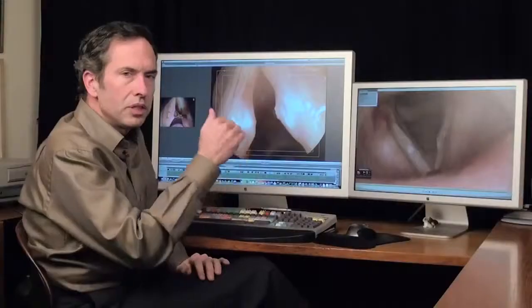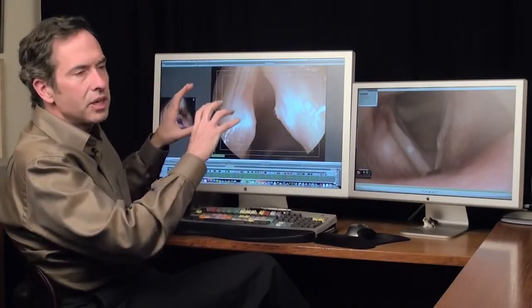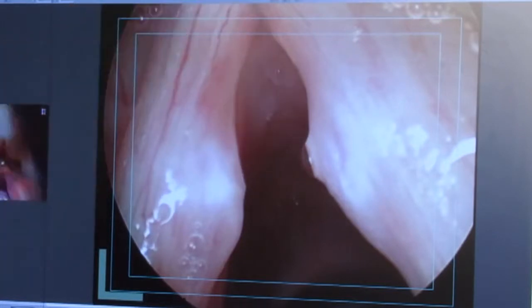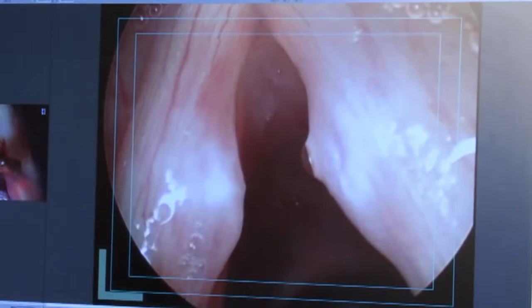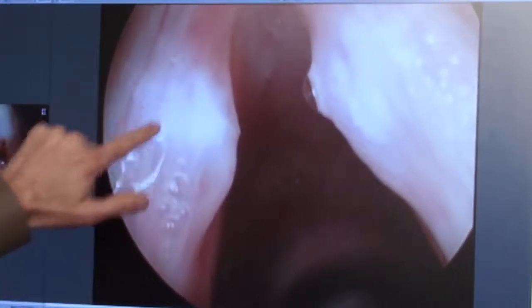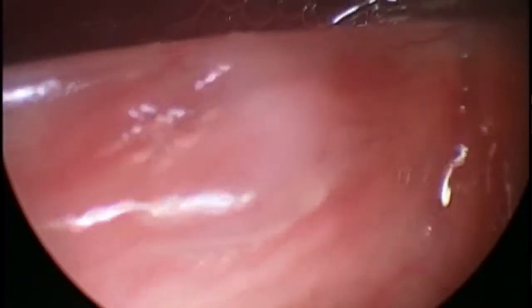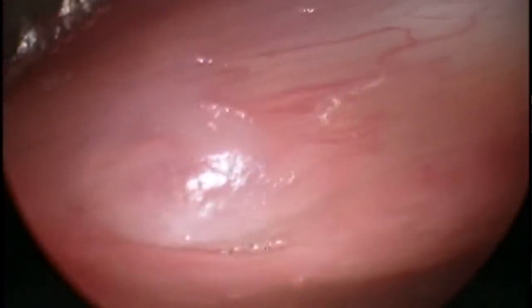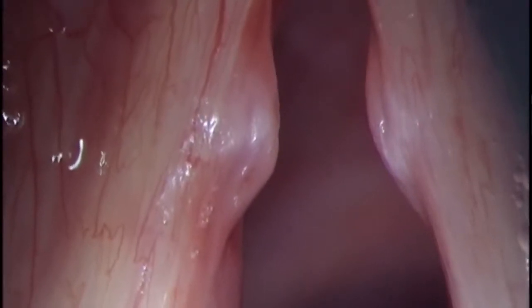Here I am looking down her throat. Now, the image is upside down because as a surgeon, I sit behind her head looking down her throat while she's lying on her back. So the front of the vocal cords is now here. We can see these two large swellings. And in fact, we're going to see blood vessels within them. Now, the swellings do have a white surface appearance. That's the callus part of it from her chronic overuse. And as I put the endoscope in, we can see all these tiny blood vessels within them. They are hemorrhagic polyps. The blood fills the polyp.